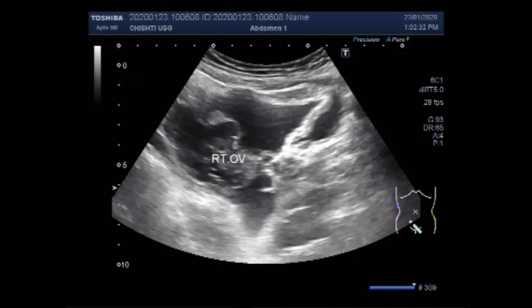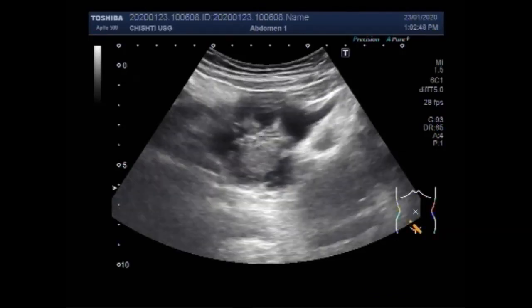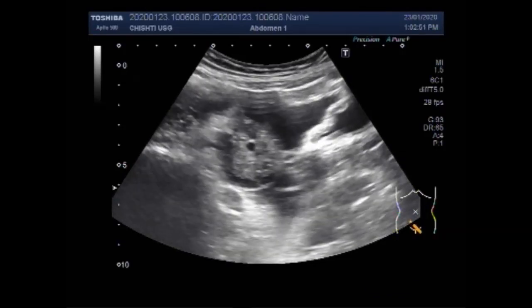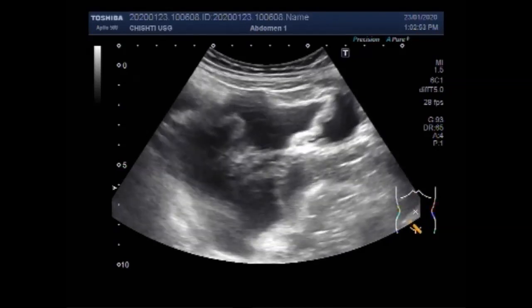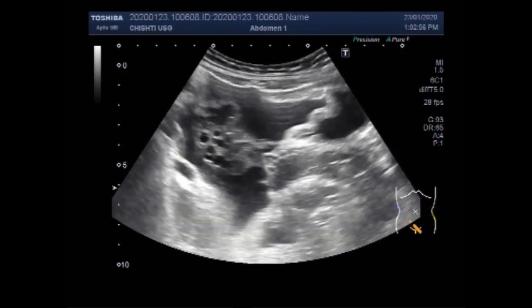This is the right ovary and this is the right fallopian tube. I hope you will get something from this ultrasonography — a rare case of ruptured ectopic pregnancy.